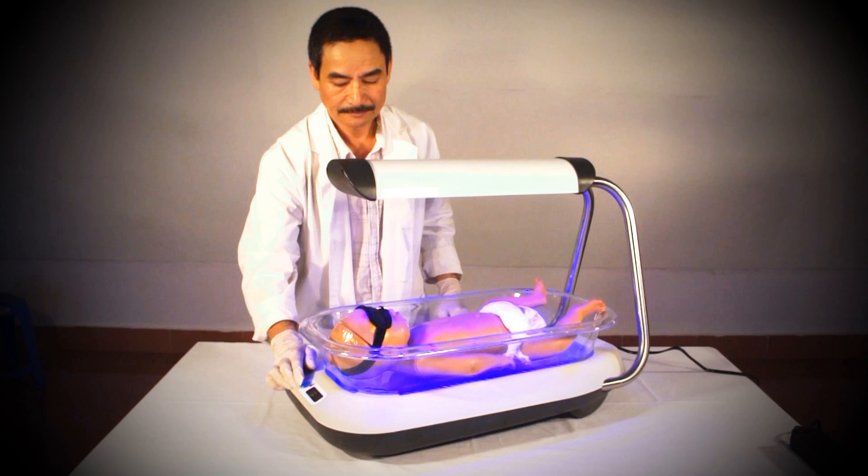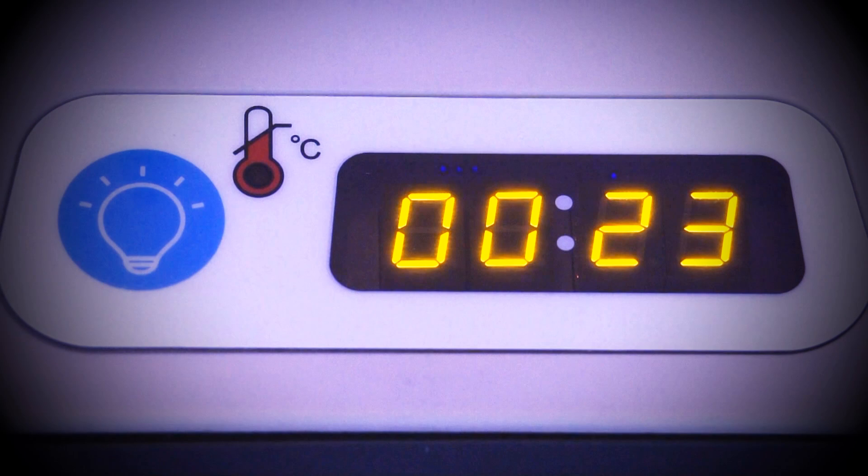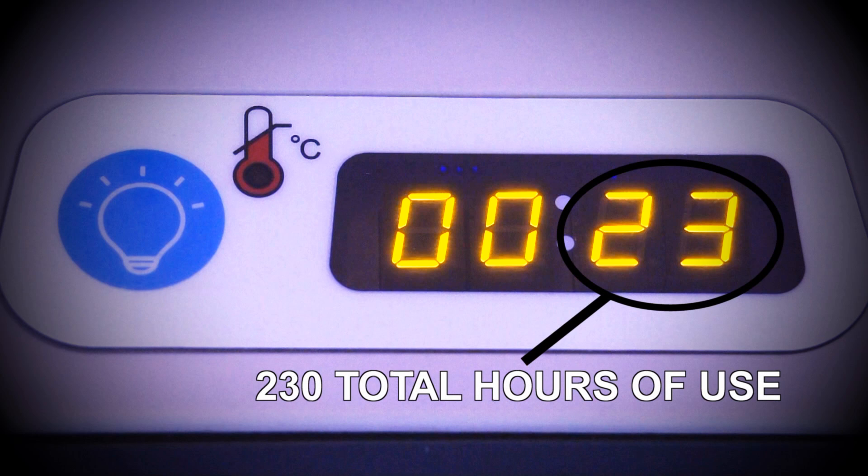The baby is now receiving intensive double-sided phototherapy. When you turn on the machine, the display screen will light up. The display tells you two pieces of information. For the first three seconds after you turn on the device, the display will indicate the number of hours that the Firefly has been used since manufacturing. To determine the total hours of use, you need to multiply the number displayed by 10.